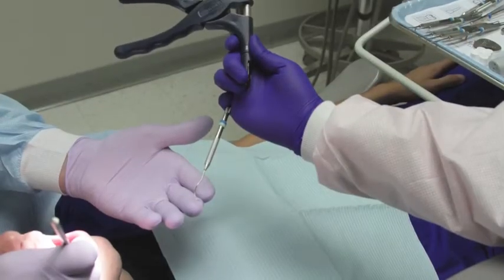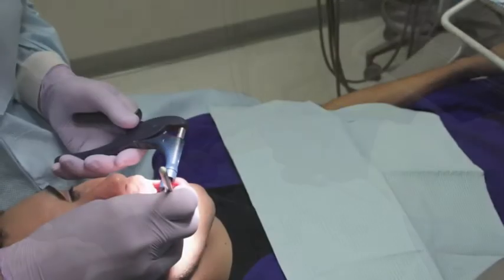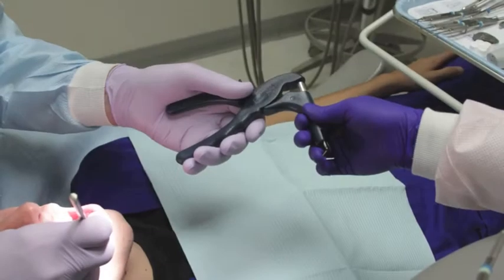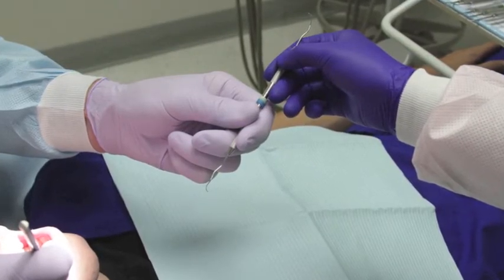In these images, notice how the assistant is able to grasp hold of the explorer and at the same time be able to effectively pass the composite dispensing gun in a very efficient manner by holding the working end, giving the handle of the instrument to the doctor.